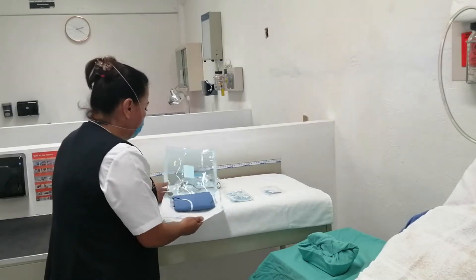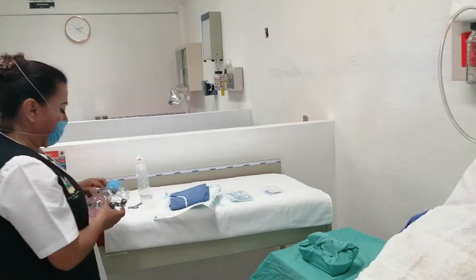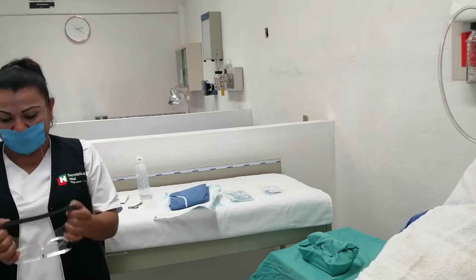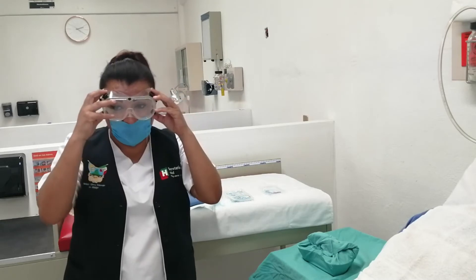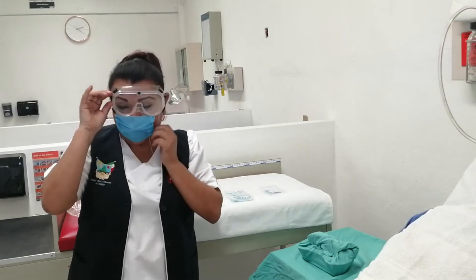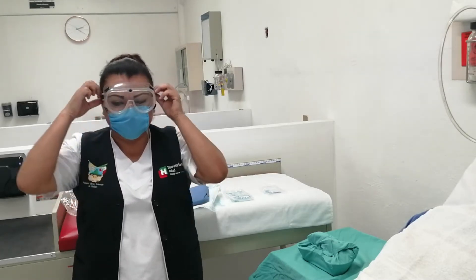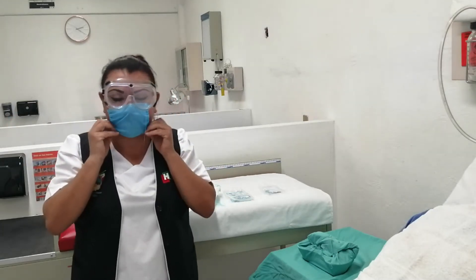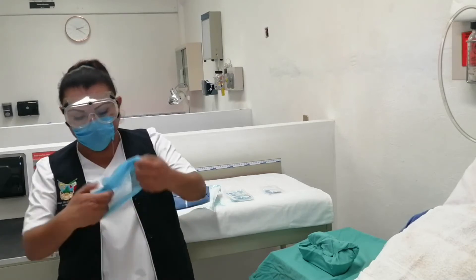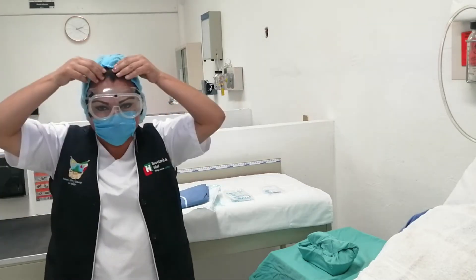Posterior a esto, tenemos que proteger las mucosas de los ojos, por lo tanto lo segundo que me coloco son los goggles o lentes. Los jalamos y aplicamos, ajustándolos muy bien para que durante la técnica no estemos ajustándolos. Una vez en contacto con el paciente no podemos tocar nada. También colocamos el cubrepelo. Recordemos que no podemos traer aretes ni joyas.